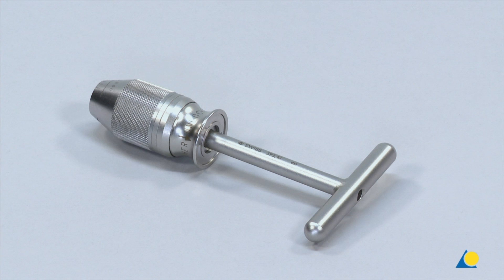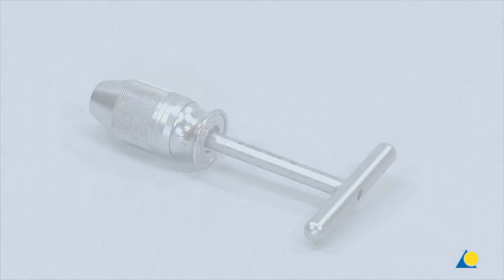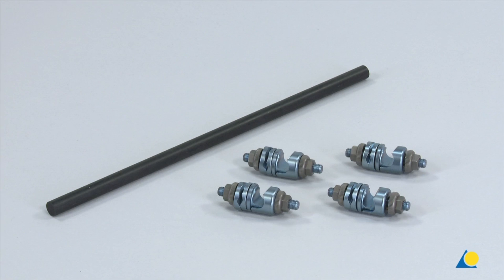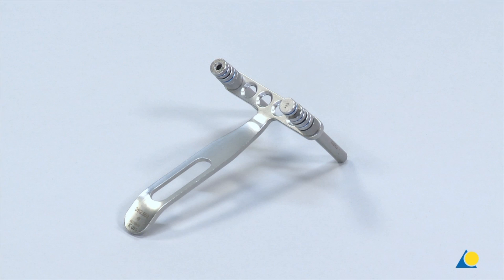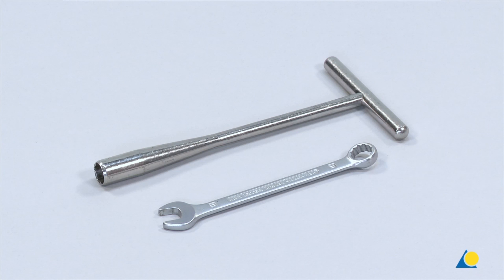The cannulated universal chuck with T-handle may also be used to advance the Schanz screws. For the construction of the uniplanar single rod frame, one 300 mm long, 11 mm diameter carbon fibre rod and four large open self-holding clamps are needed. Also needed are the handle for drill sleeves, the long 8.0/6.0 drill sleeve with thread, the long 6.0/5.0 drill sleeve with thread, the long 5.0/3.5 drill sleeve, and the long 3.5 trocar. To tighten the clamps, the 11 mm cannulated socket wrench and the 11 mm combination wrench are used.